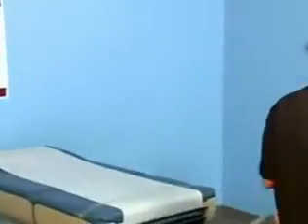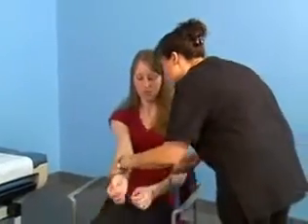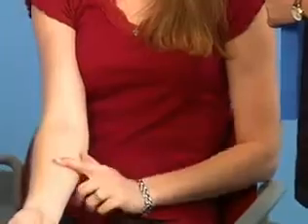Explain the procedure to the patient and offer reassurance to reduce fear or apprehension. Perform a preliminary assessment of both arms to determine the best vein to use. Ask the patient which arm has been used in the past to obtain blood.